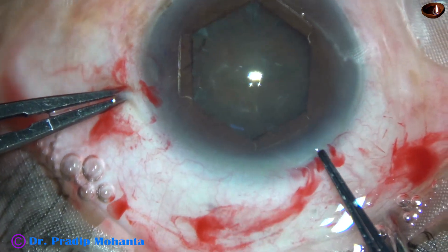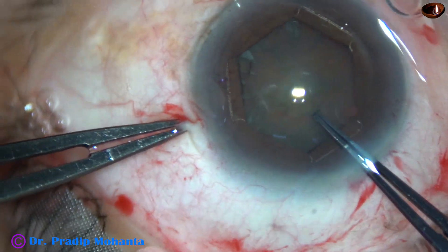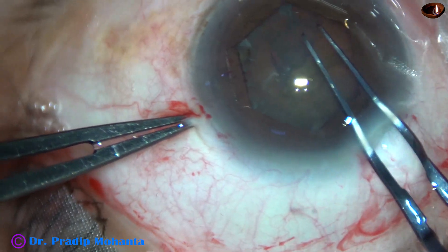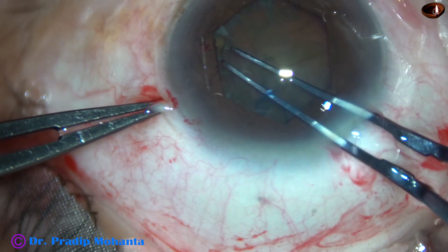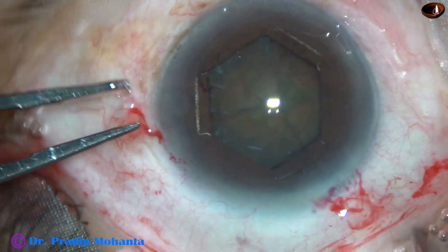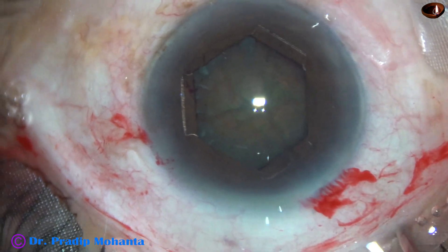This is a very thin device. We don't need any injector system for applying and for removal of this device. Now, this is CCC — continuous curvilinear capsulorhexis. A CCC of about 5 mm is obtained with this device as we go along the margin of the dilated pupil.